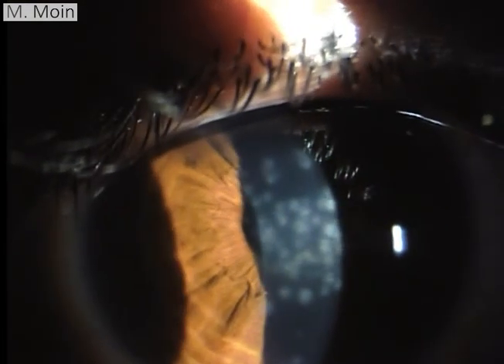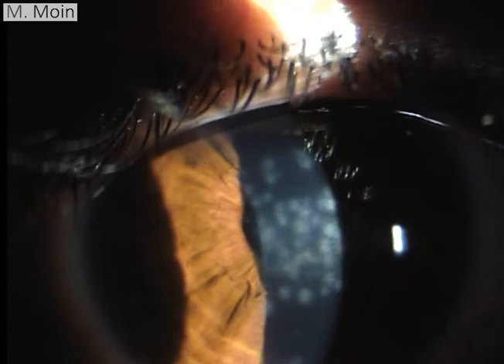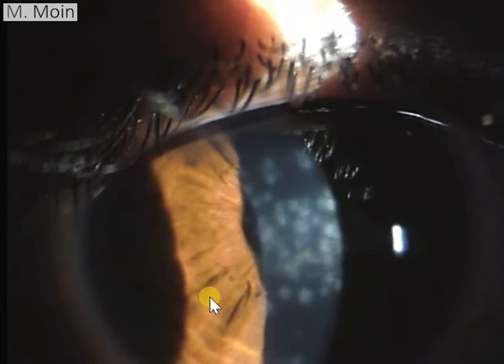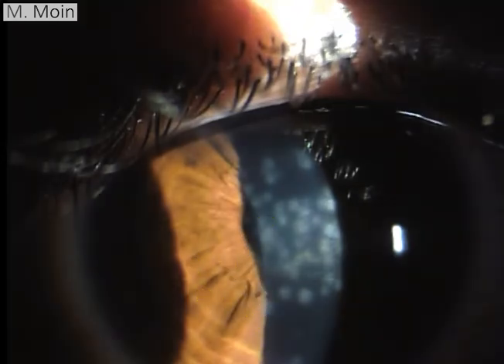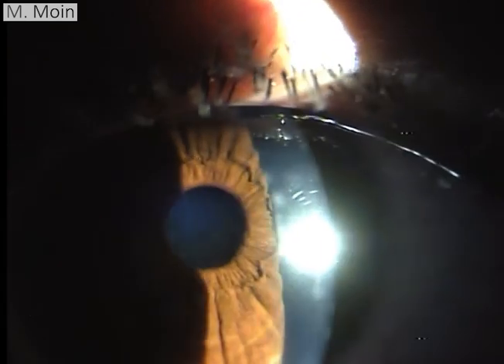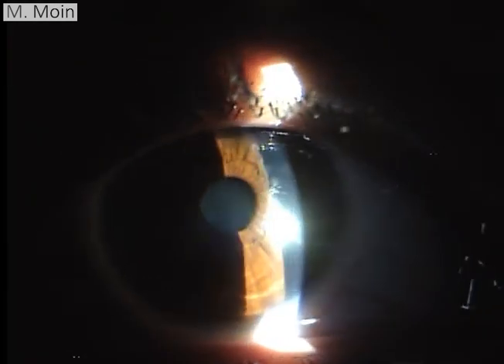You can go on to see these lesions on diffuse illumination, and then you can do a retro illumination of the iris. When the light falls on the surface of the iris, you can actually see these lesions in retro illumination of the iris as well. Thank you very much for watching.